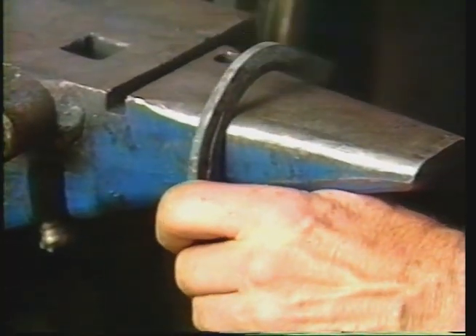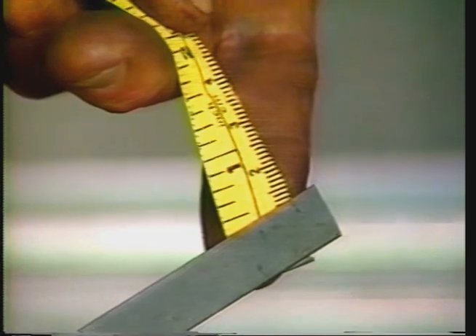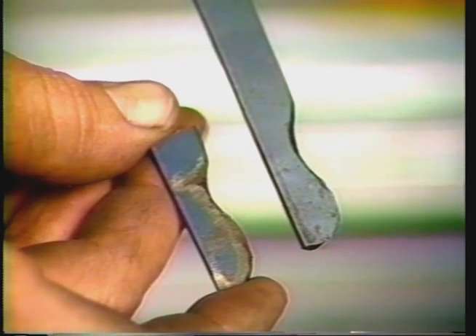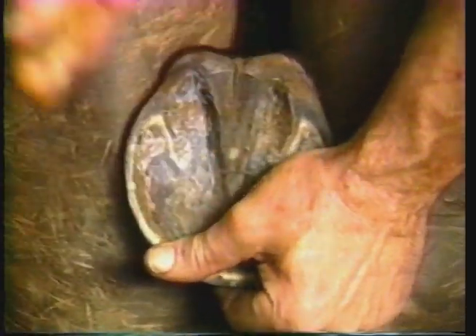Once that shoe has been fitted as you want — the heels should be touching with no space — take your knife and cut a small notch in the toe. The head of the rivet does not need to be ground off nor beat down too flat because it must be kept very strong. When you fit the shoe, it should fit in a proper fashion as if it were a normal bar shoe. Now you make your rudders to go in against the bars. I refer to them as rudders because they are actually the mechanical push you need to spread the heels. I use approximately 12-gauge metal.